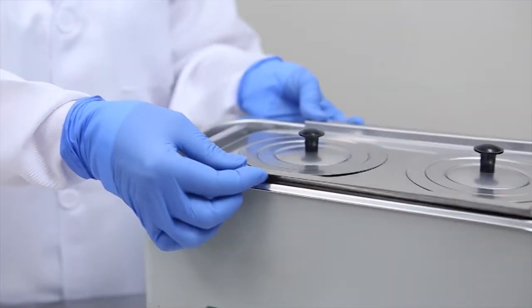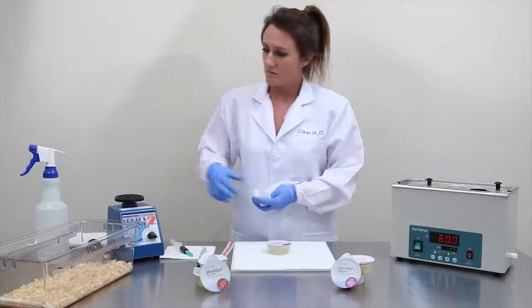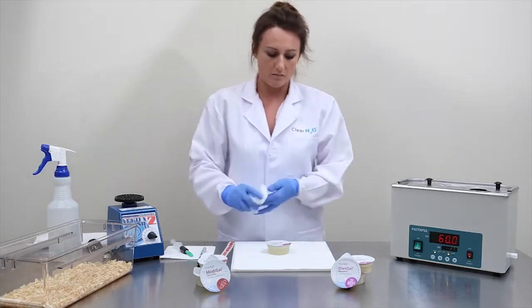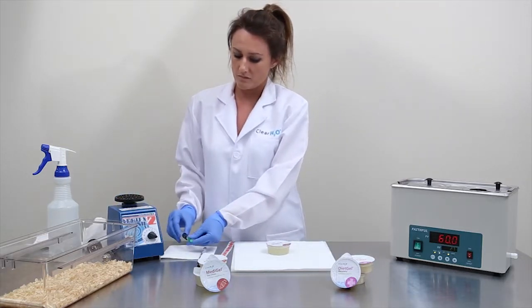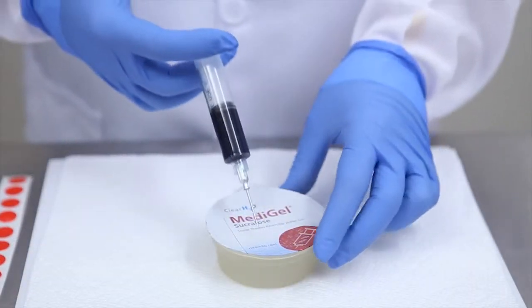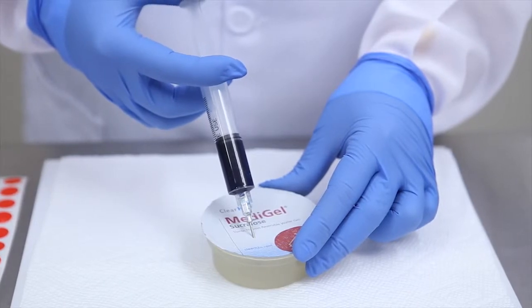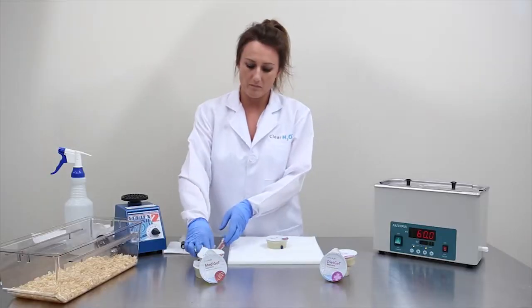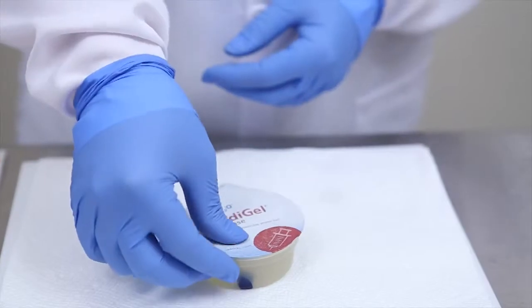After removing the cup from the water bath, follow aseptic technique to prepare the cup lid surface for injection of your medication. After previously determining the medication dosage concentration required for the MetaGel 2-ounce cup, using a syringe, carefully insert the needle through the cup foil lid and inject the required volume of medication. After carefully withdrawing the needle, place a sticker over the injection site and ensure good adhesion.